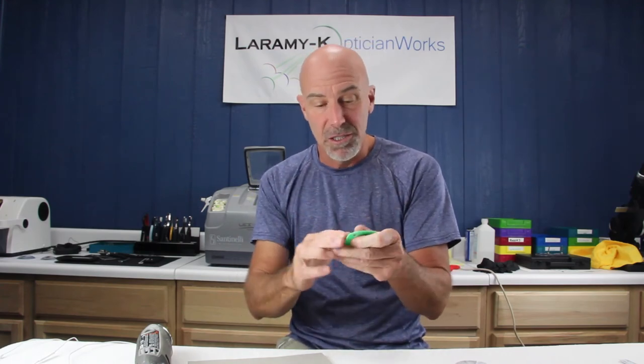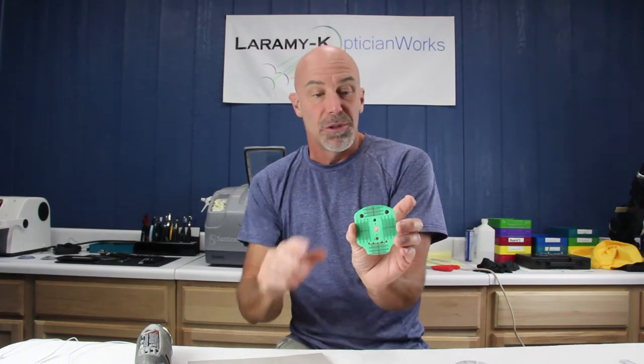I cut, I sanded, I smoothed, I went on the wheel, I used my own grinding stone. I started with it, it was a little bit too large, put it into the edger. It didn't work. Had to take it out. For every success, you're going to have 10 failures when you're doing this stuff. So you have to practice.